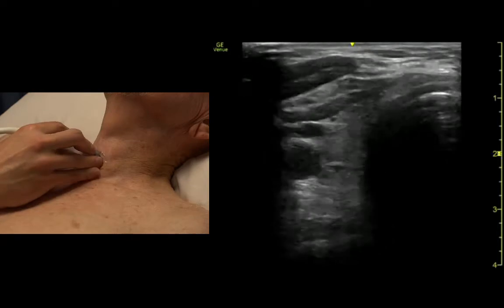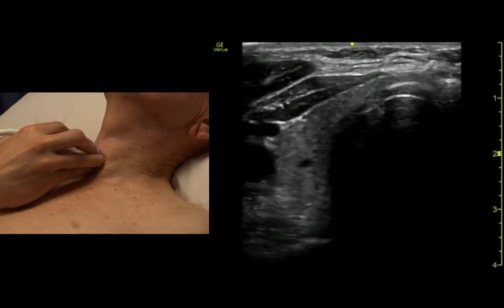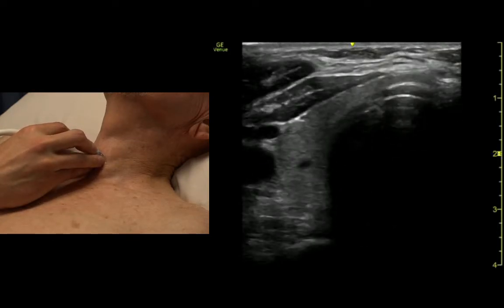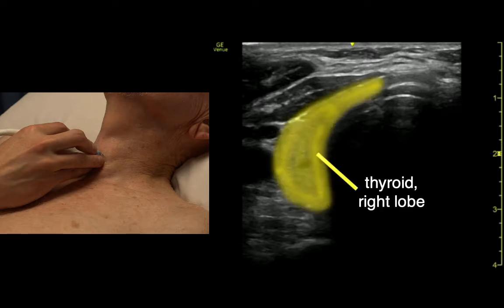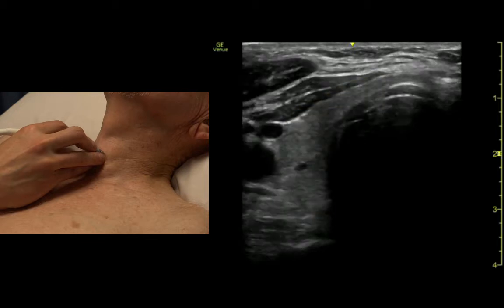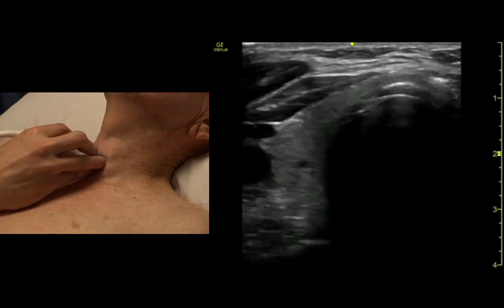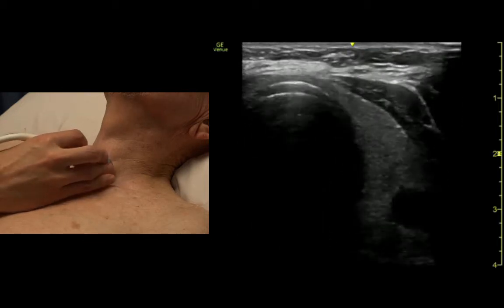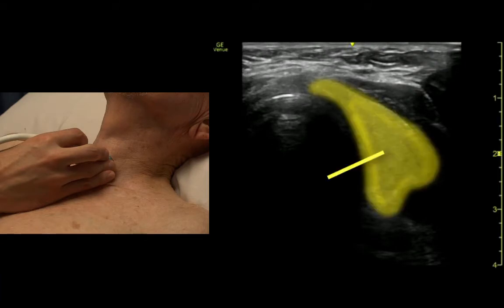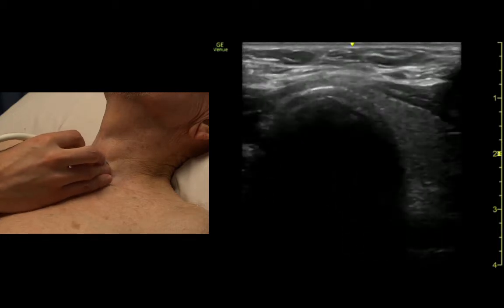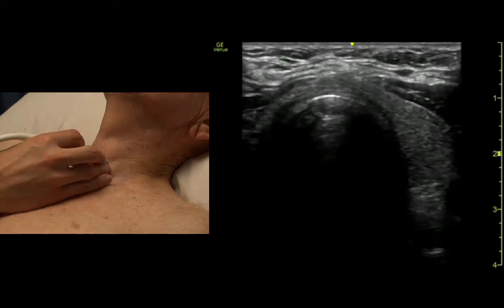To either side of the trachea, we should see the lobes of the thyroid. There's the right lobe of the thyroid — just this little gray area — and there's the left lobe. And if we're careful, we can see the isthmus going across.